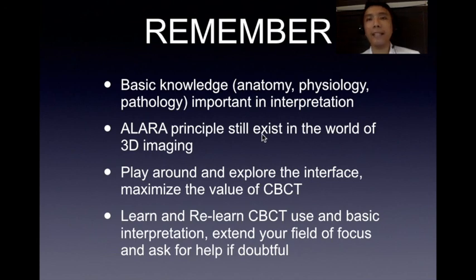So, as recommended, if a plain film periapical radiograph would suffice, moving to a higher exposure might not be as sound in terms of judgment.